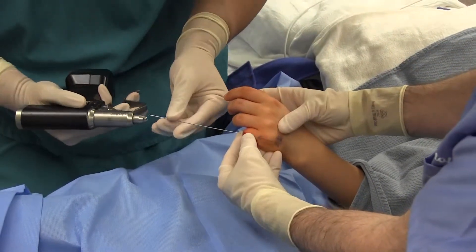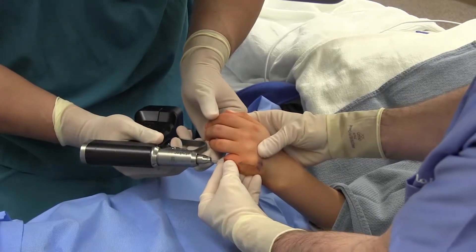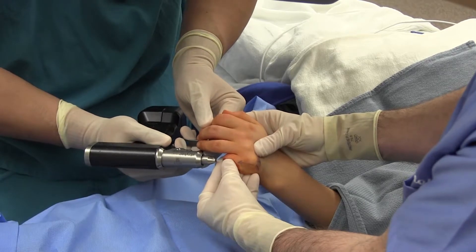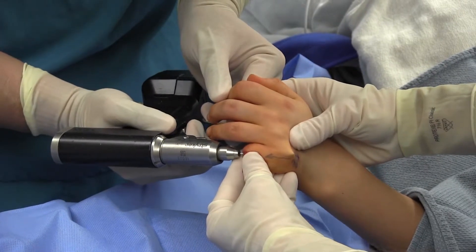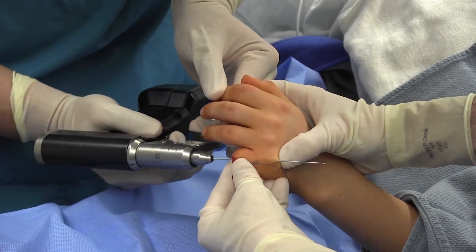Malrotation was checked. The k-wire is then drilled in a retrograde fashion and out the skin. The metacarpophalangeal joint is avoided.